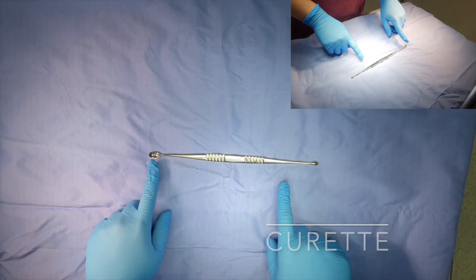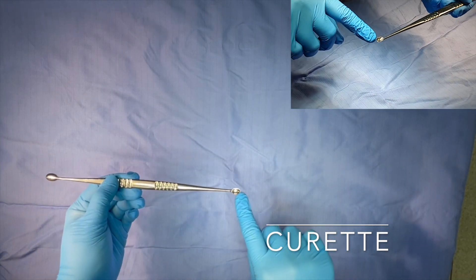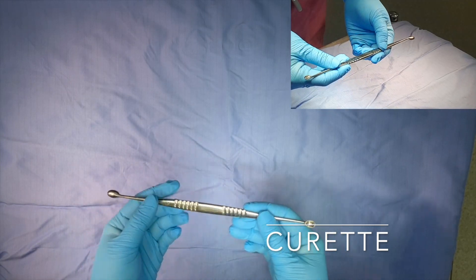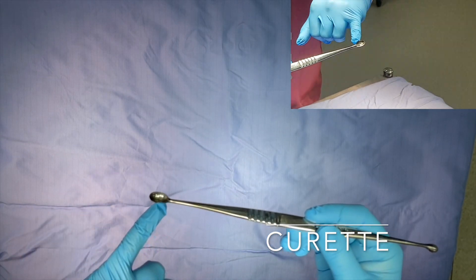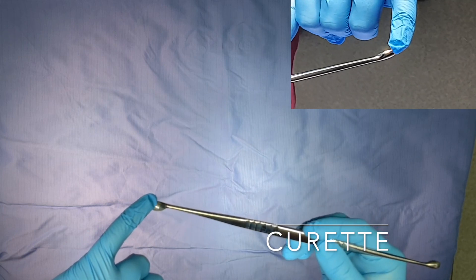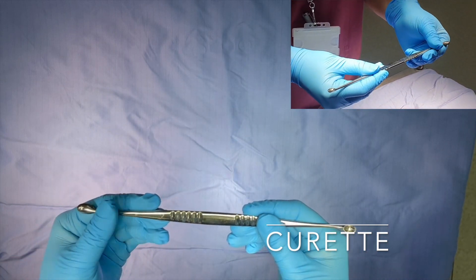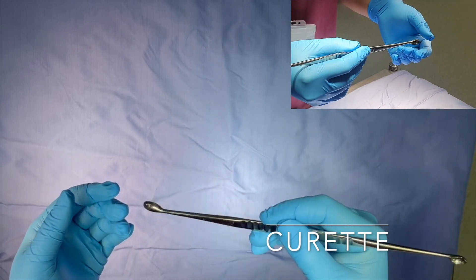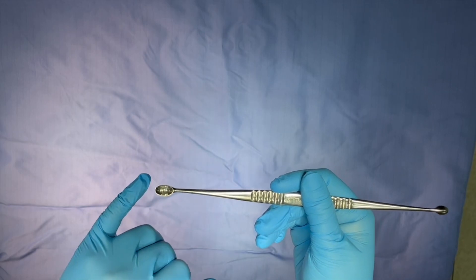Finally, we have a double-ended curette with a large size on one end and a smaller size on the other. It is used for scraping material such as debris during surgery and procedures including abscess drainage and sebaceous cyst removal. The purpose is to scrape away any residual material that might be left inside. It does have a slightly sharp edge, so it must not be used with too much force.